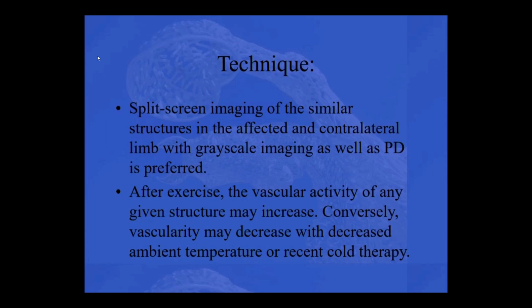What you also could see is that after exercise, the vascular activity of a certain structure may increase. That also makes it important that when you do more evaluations over time, you always do them at the same time. If you look at a certain structure to see the effect of treatment or rehab, and the first time it was before work and then the second time it's after work, you can get really different values or different images, so use that to your advantage.